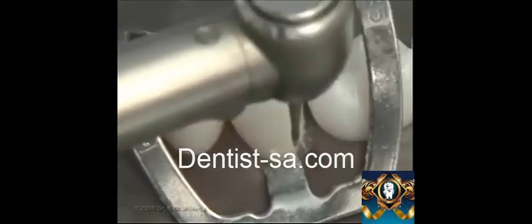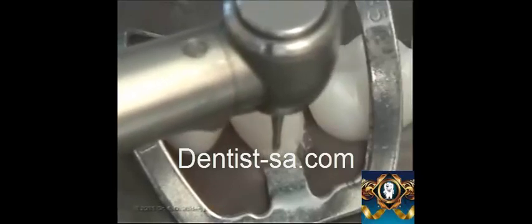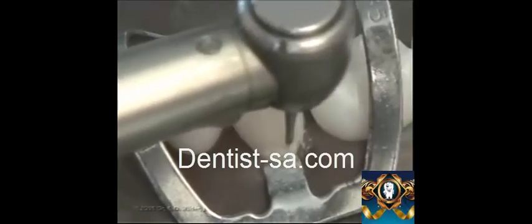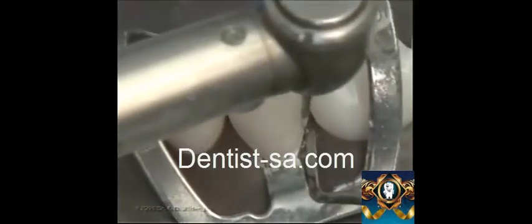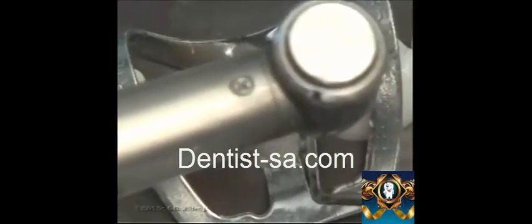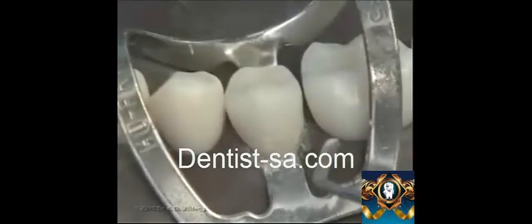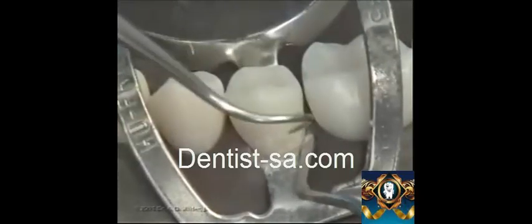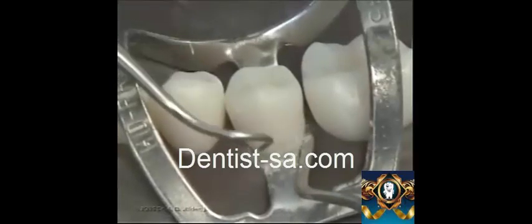The contouring is done carefully so as not to remove too much composite, which could leave an underfilled restoration. The rubber dam retraction is done using a blunt-end instrument like a plastic filling instrument to get the burr past the axial angle of the tooth surface. Contouring with the tungsten carbide burr is continued. The explorer is again used to evaluate the margin and the restoration for any voids or excess flash.